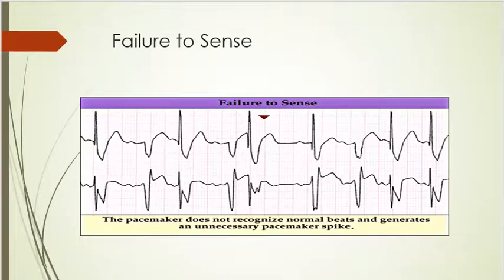They can talk to the implanted pacemaker underneath the skin through this computer. These really fancy pacemakers now, they can see it from 100 miles away, and the cardiologist can say the sensitivity needs to be here, the output needs to be here, we maybe need to change it.